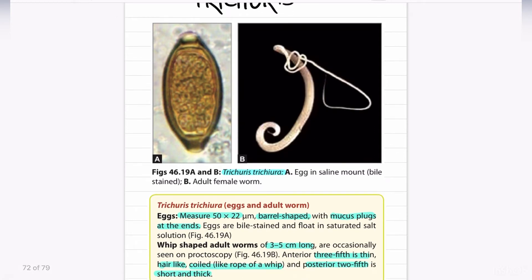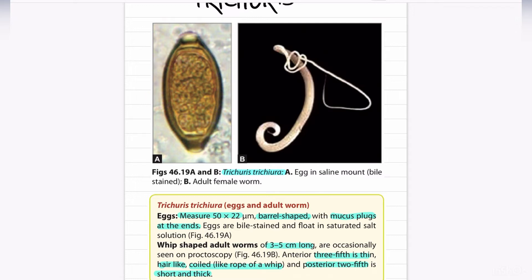Next is the egg of Trichuris trichiura. The egg of Trichuris trichiura is barrel shaped with a size of 50 by 22 micrometers, with mucus plugs at each end. The shape of the adult worm is whip-shaped and measures three to five centimeters long. The anterior three-fifths is thin and hair-like, and the posterior two-fifths is short and thick.